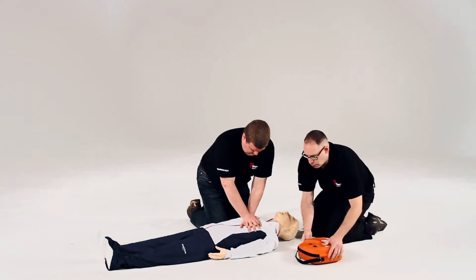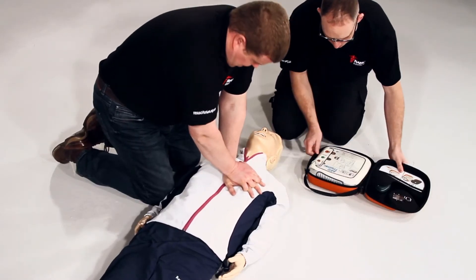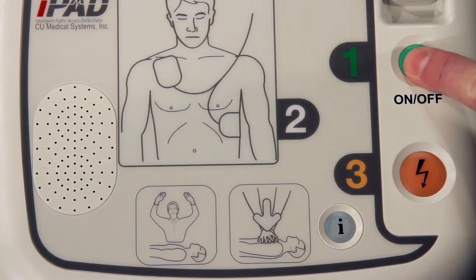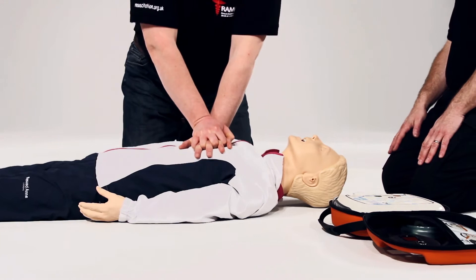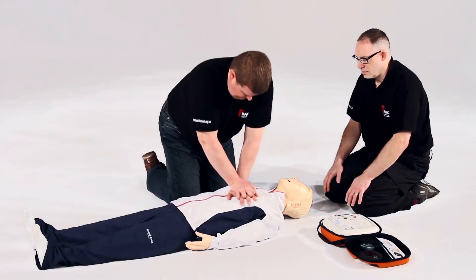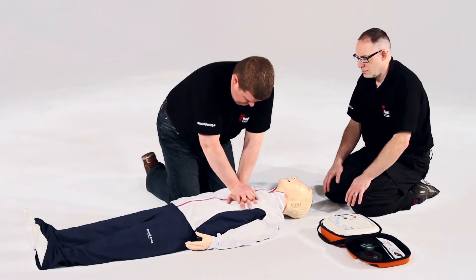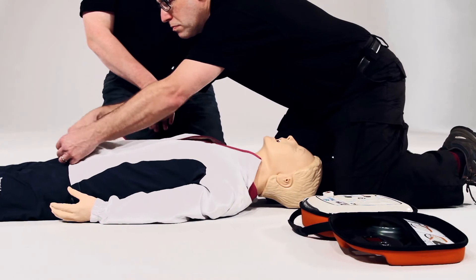You carry on, I'll work around you. Adult mode. Follow the voice prompt calmly. Remove all clothing from chest and stomach. Rip clothing if necessary.